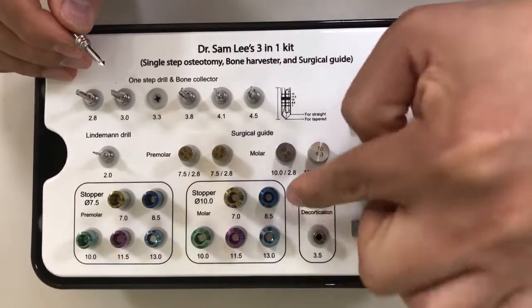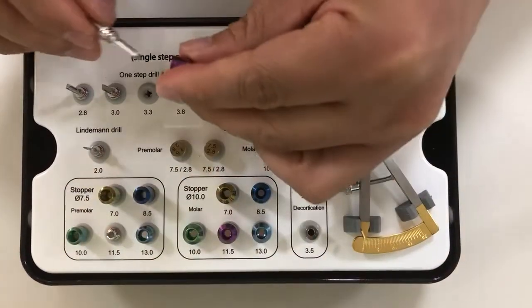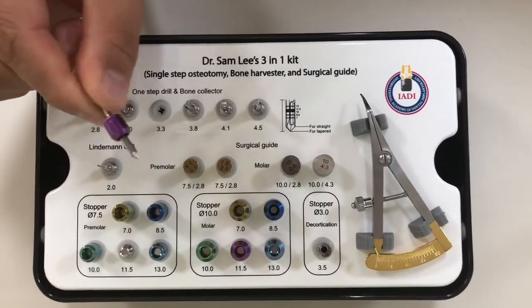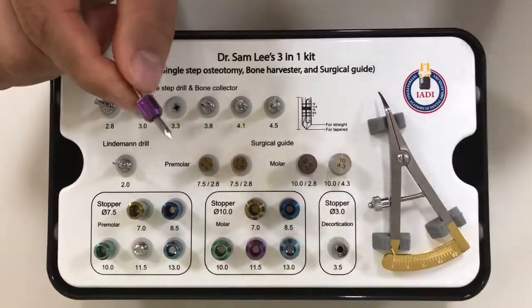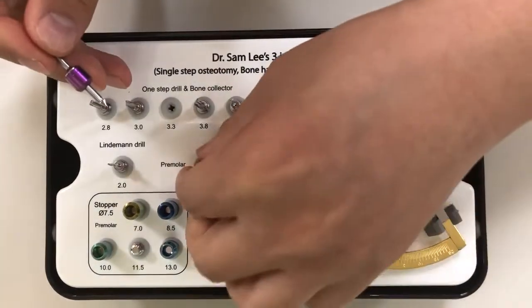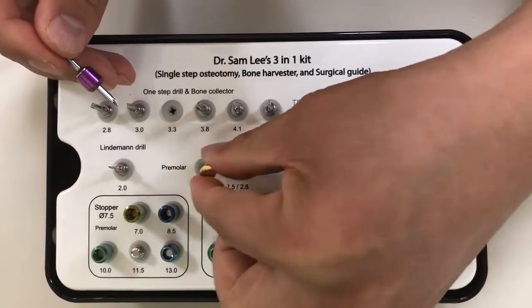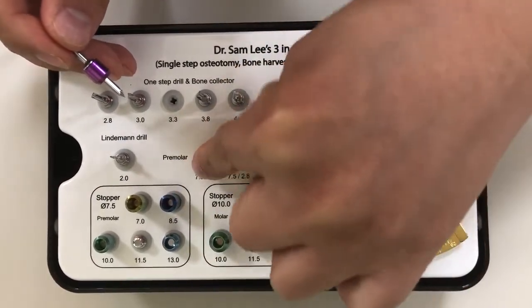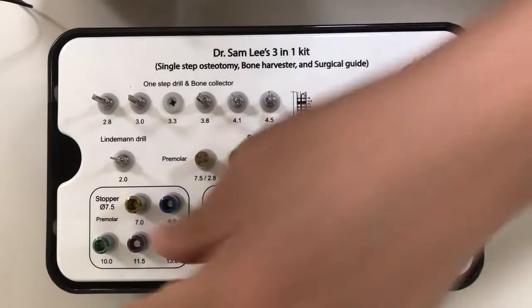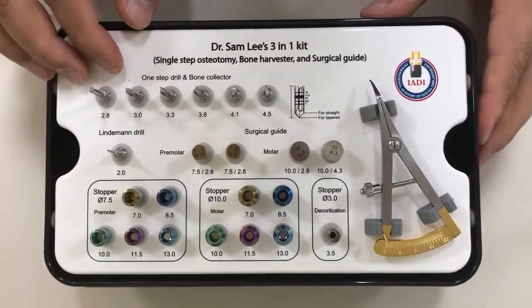For a bicuspid implant with 4.0 by 10 millimeters, I will pick the 3.3 millimeter drill by 11.5. If you are doing multiple implants, after this drill you will use this to help you position implants in a multiple-implant scenario and measure the distance mesiodistally.